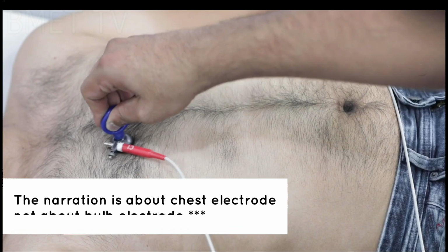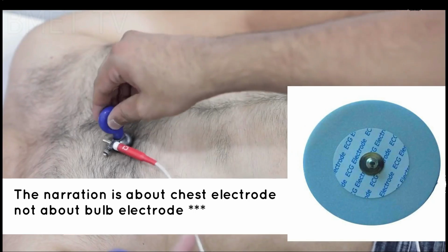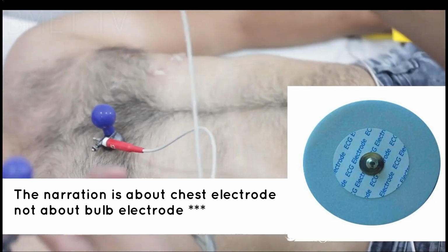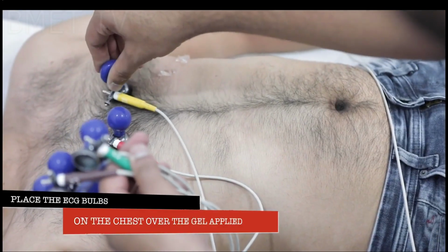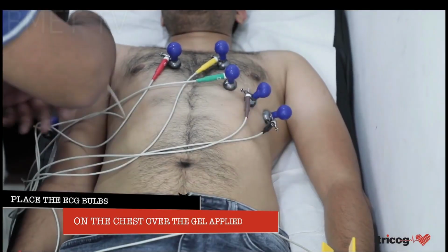Each electrode consists of an electrically conductive electrolyte gel and a silver chloride conductor. The gel typically contains potassium chloride, sometimes silver chloride as well, to permit electron conduction from the skin to the wire and to the electrocardiogram.